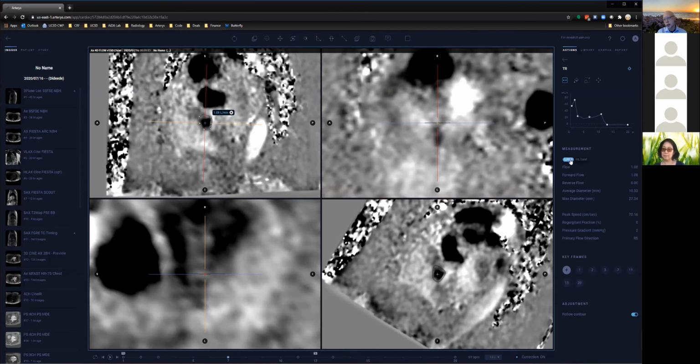So for regurgitant fraction, we have a good paper I think that was in JMRI 2015 or something like that, that one of my former residents wrote, who's also a faculty at the VA, Jen Fennis, and she did direct and indirect measurements of mitral and tricuspid regurgitation, and we have the equations there that people can follow.